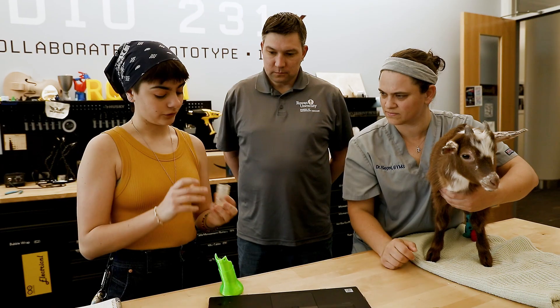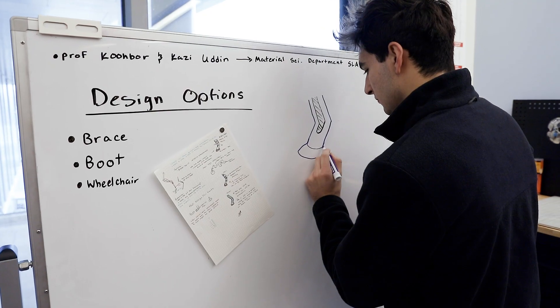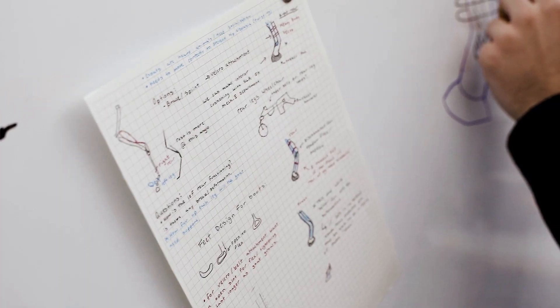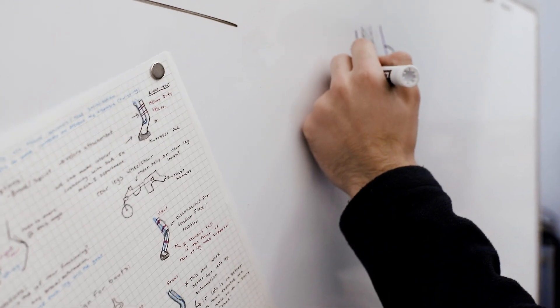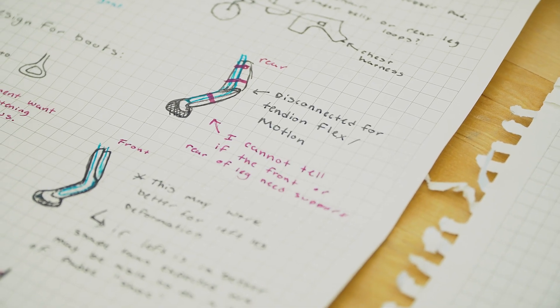We had faculty and people from the vet school to help with our questions, because as mechanical engineers we aren't well versed in the anatomy of a goat. We went through probably five iterations of legs in the span of about three weeks. Since Fortunato was a baby goat who would get bigger, the prototype also had to be adjustable, which really changed the designs around a lot.